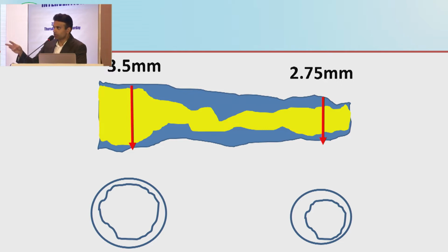So going back to pearls, plaque we talked about, your distal EEL to EEL we talked about, A is your lesion length, right? So let's call this lesion length whatever you want to call it. 18 millimeters. Let's say it's 18, okay? R is your reference vessel size.